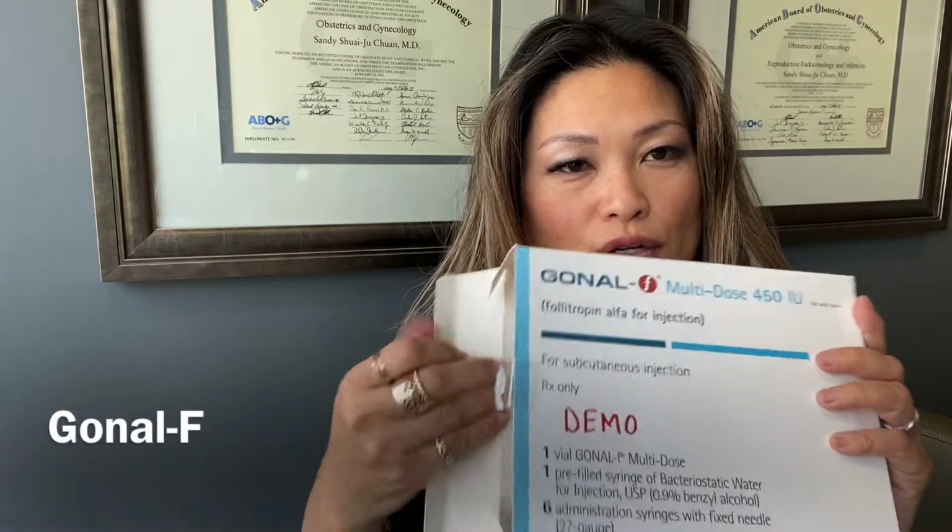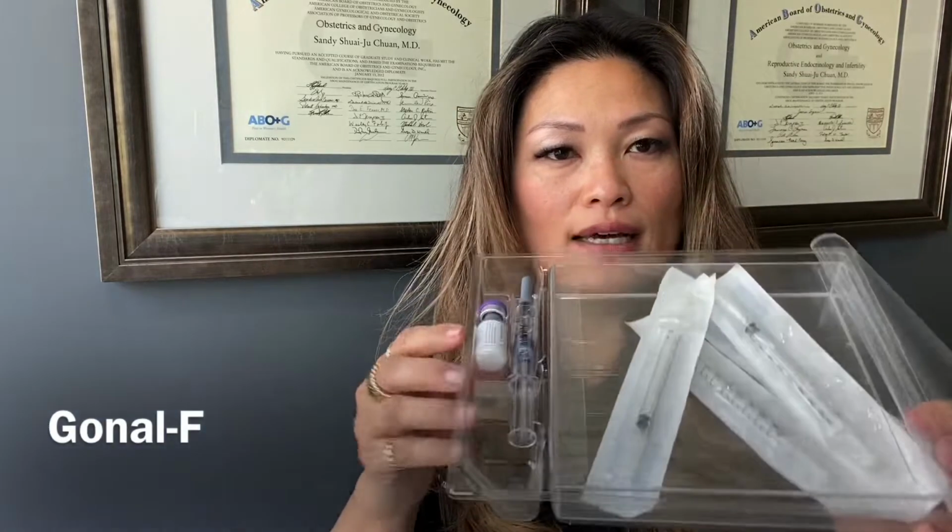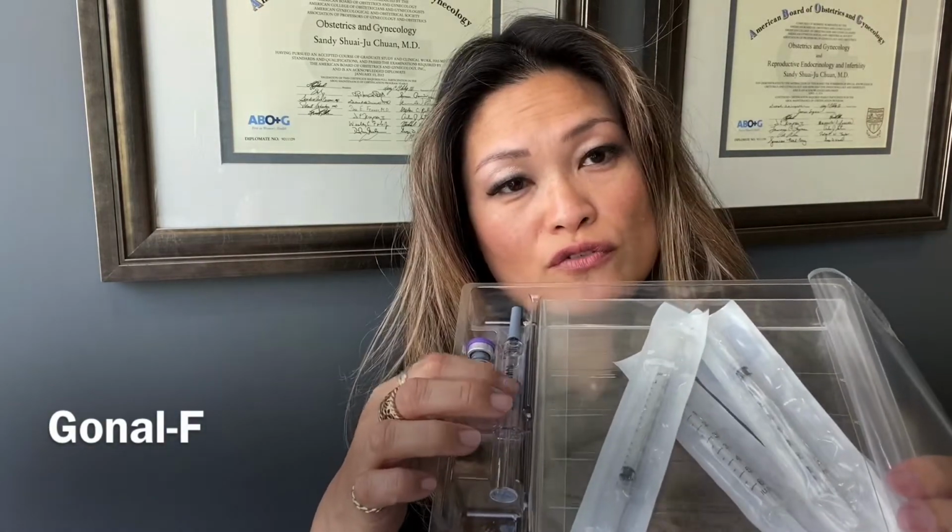And the next thing you want to do, because you're usually going to be starting with Gonal-F and Menopur, is take out your Gonal-F. And obviously this is a demo box, so it was already open, but you want to make sure that this seal is not broken. That's one sign to make sure that it's a brand new box. And then usually when you get your box, it's going to have this plastic seal on it. You want to make sure that that's sealed as well. And in your box, you're going to get powder, a syringe with fluid in it, and then you're going to get all these special needles. Okay, and I'm going to tell you about that.